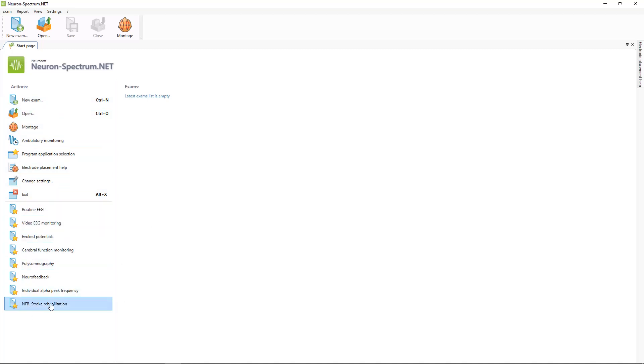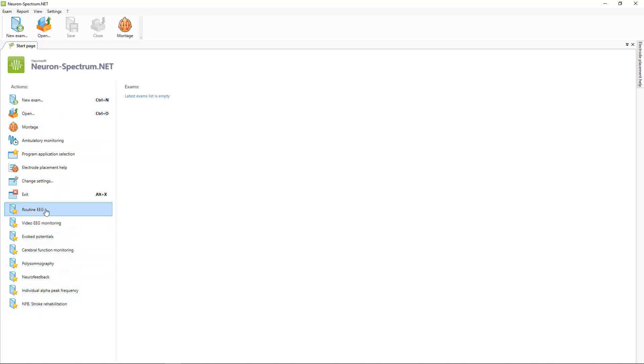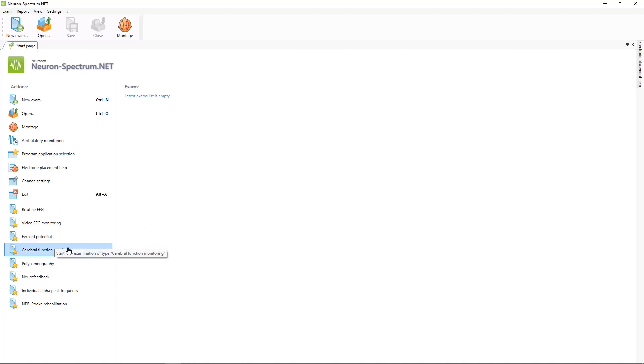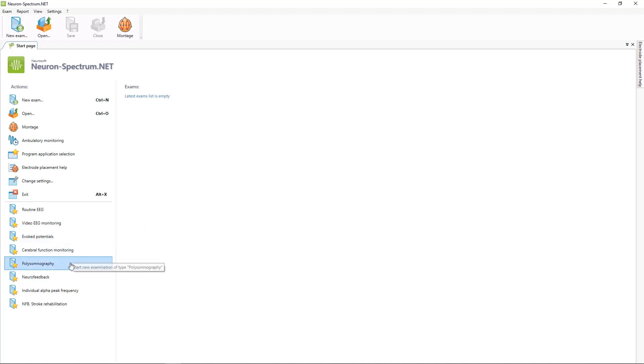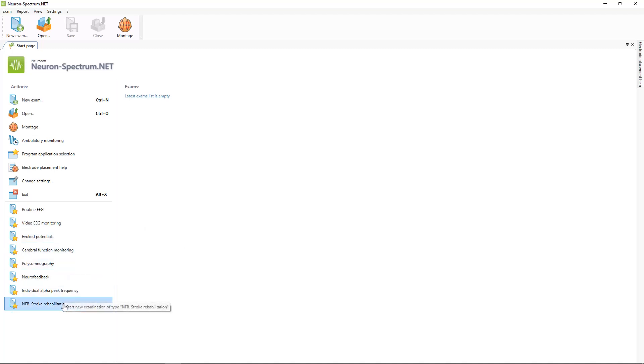And here are examination templates. With help of this command, you can start, for example, routine EEG, video EEG monitoring, evoked potentials recording, and other types of examinations.